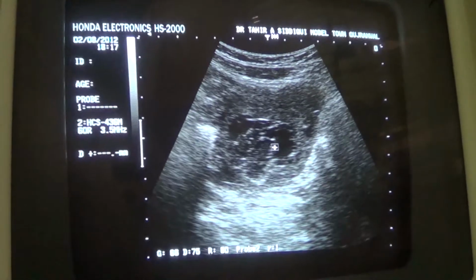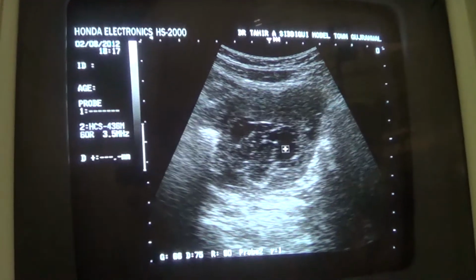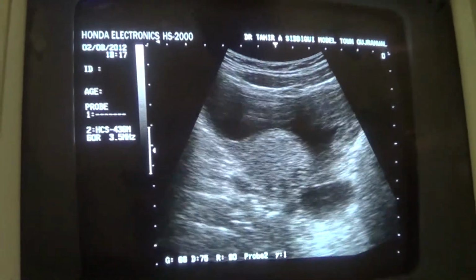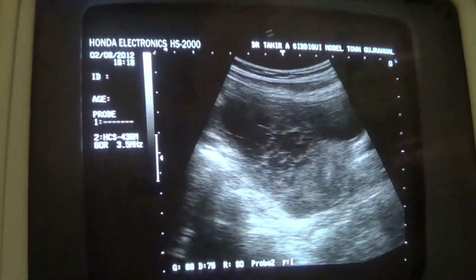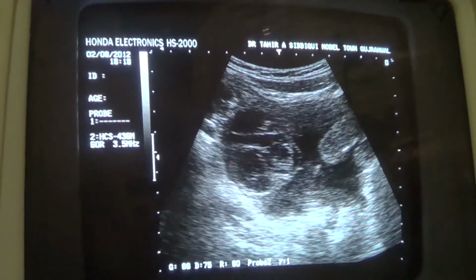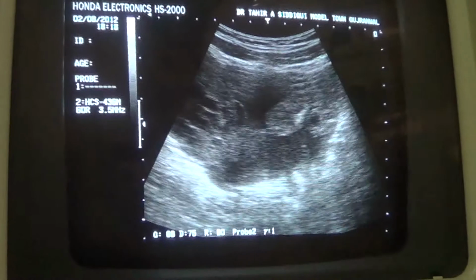Now if you concentrate on this area, this is not as black as this area is. Clear fluid will appear as you are seeing in this region. This is clear, but this is full of debris. So this finding is, as the right ovary is not visualized separately, a tubo-ovarian mass of infective nature in the region of the right adnexa that is also surrounded by the ascitic fluid.